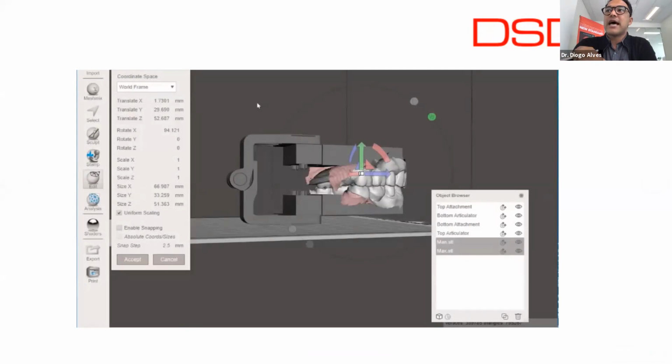And that's something that we will also teach you in our online composite veneers course, how you can create a digital articulator using Mesh Mixer, this free, amazing software. And Javier will be giving you a little bit of an overview of how it works.